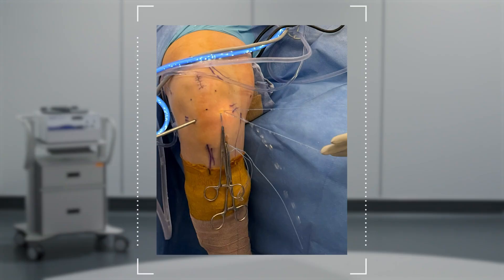This allows tension on the suture and allows for the passage of the graft without worry that the tibial shuttle sutures will get pulled in.